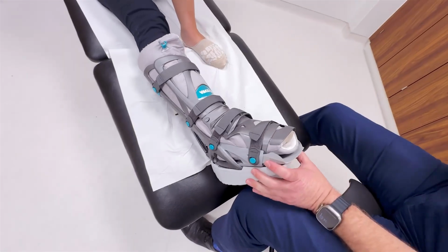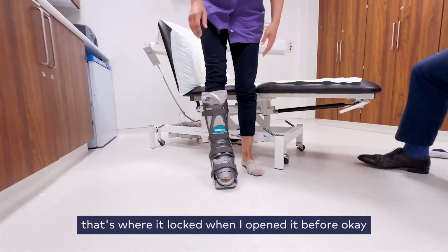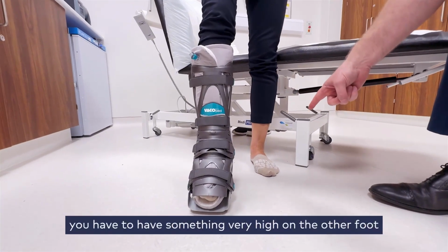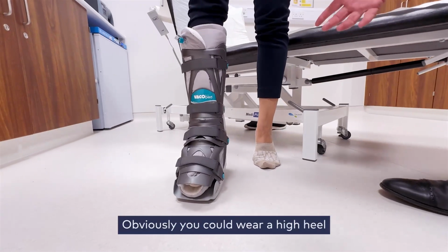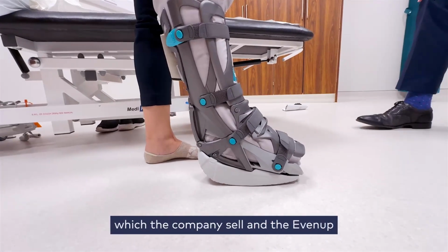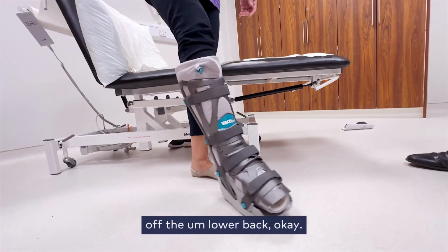Okay. Now, what you can now do is stand up. Okay, that's where it locked for when I opened it before. Okay, and you can see that it's almost impossible to walk on one high heel, so you have to have something very high on the other foot in order to even up. Okay, obviously you could wear a high heel, or you could wear a normal thick trainer, or some people buy something called an even up, which the company sell, and the even up sits onto the bottom of the other trainer and then lifts you up, so it takes the strain off the hips, off the lower back.